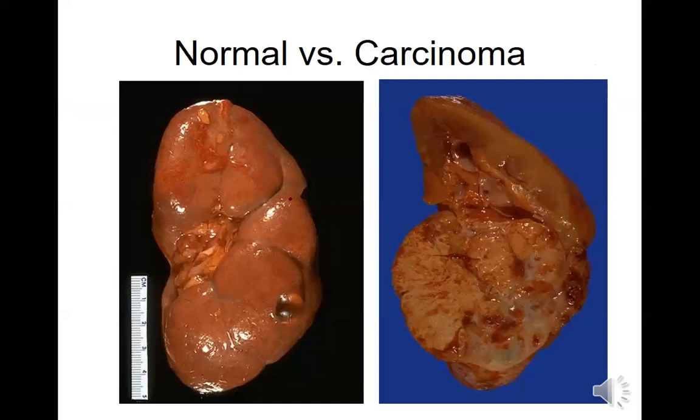So you can see, again, this was that normal we saw, which is a very young kidney. This is a normal cyst. This is a young fetal, maybe even kidney, because most kidneys don't have these lobulations. Your kidney has maybe 6 to 8 lobes as an adult, with all the medulla surrounded by the cortex. So it doesn't look like this in an adult, it's smoother. But the point is, this tissue is gone.